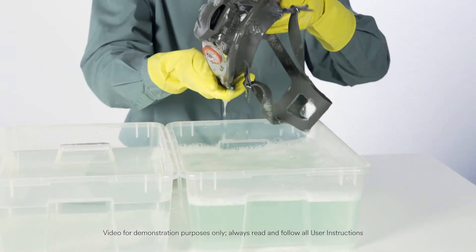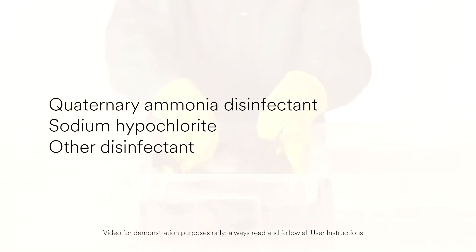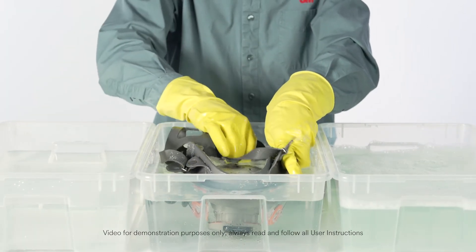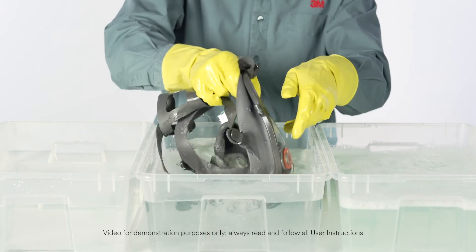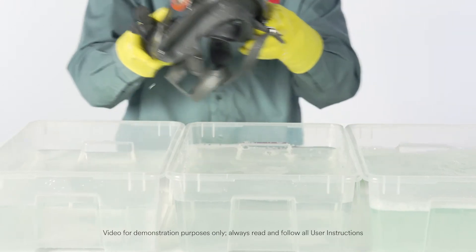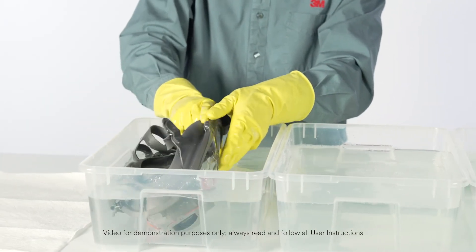Disinfect the facepiece by soaking it in a solution of quaternary ammonia disinfectant, sodium hypochlorite, or other disinfectant. Rinse the facepiece in fresh, warm water and air dry in a non-contaminated atmosphere.